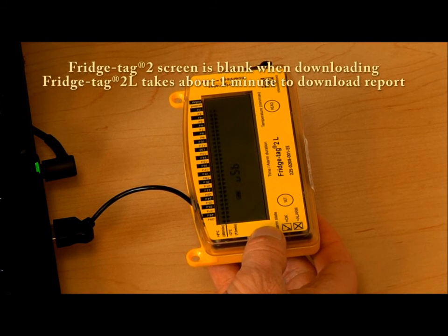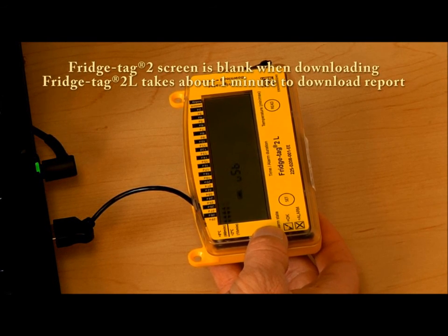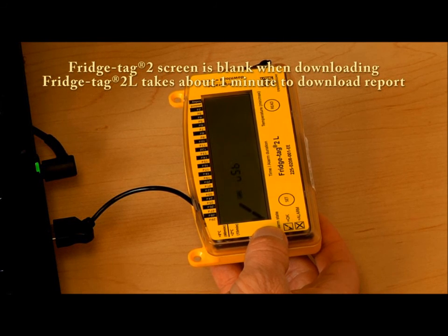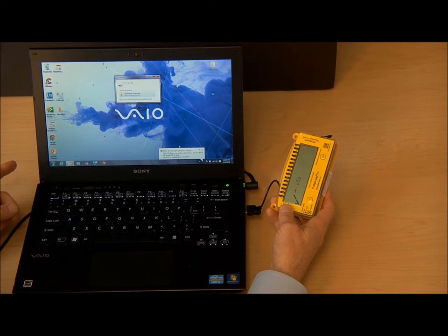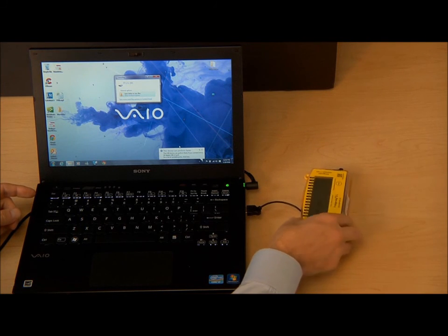When the Fridgetag 2L report is complete, the screen will move to a check mark as you can see, and the report will appear on screen.